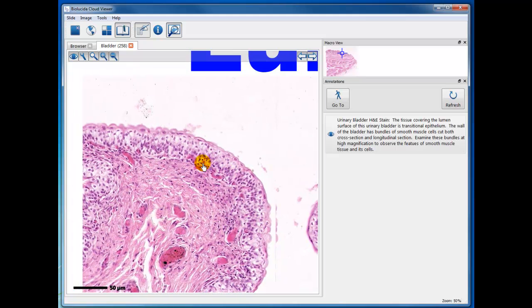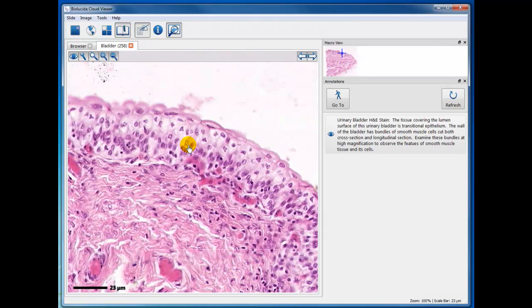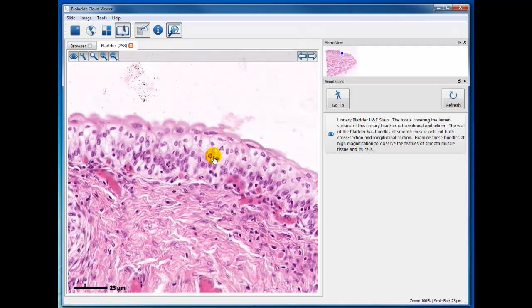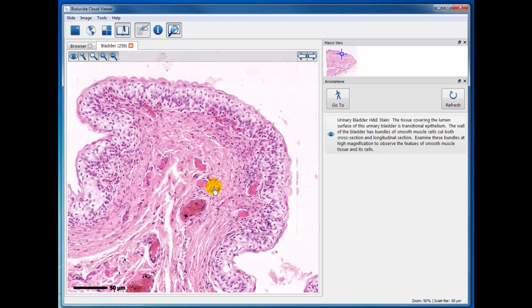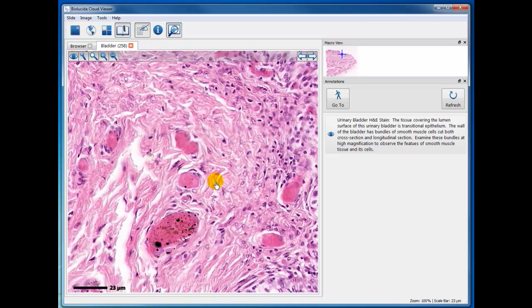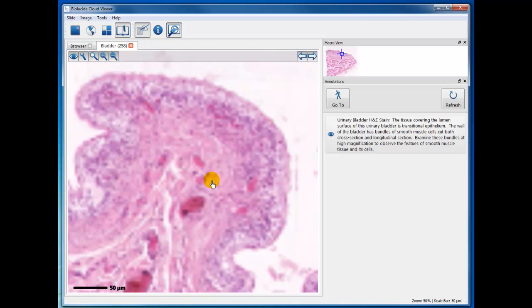transitional epithelium, and this is a very good example of transitional epithelium. The cells are dome-shaped, particularly when it's relaxed. If it's stretched, you're only going to have 2 or 3 layers, and they'll be pretty flat. And no stratified squamous, keratinized, or non-keratinized epithelium is ever down to 2 or 3 layers. So this is typical transitional epithelium. And then under here is fairly dense connective tissue with a lot of collagen fibers and fibroblasts, etc.